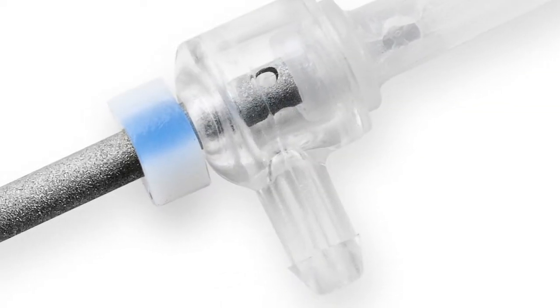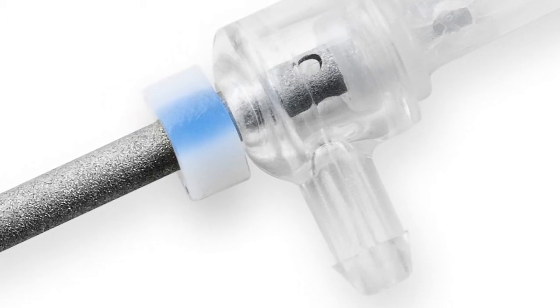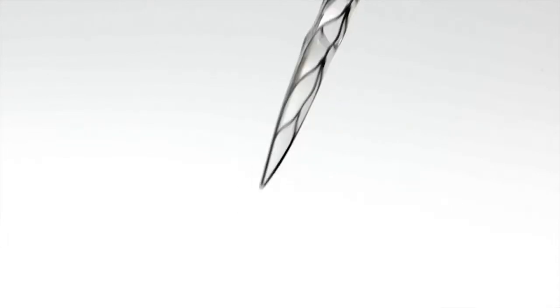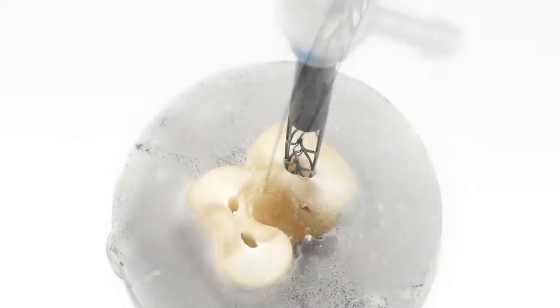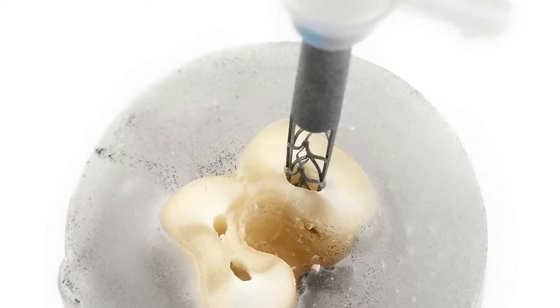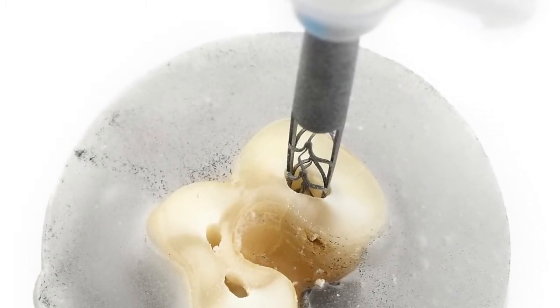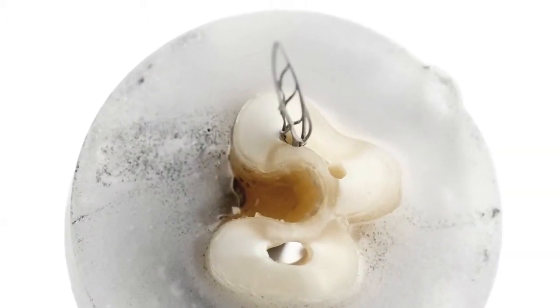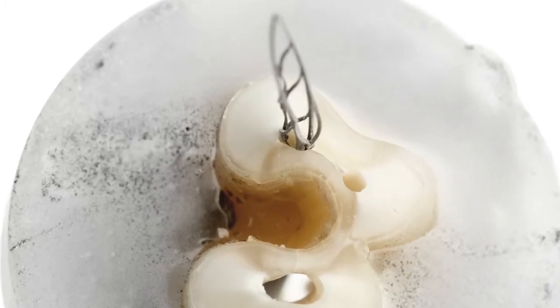An irrigation bar built into the hollow shank enables a dentist to irrigate simultaneously during shaping and facilitates superior cleaning and disinfection. The file does not impose its shape on the canal. Instead, it will custom fit itself to any root canal anatomy and shape it in a minimally invasive way, removing more contaminated dentin while conserving healthy tooth structure.